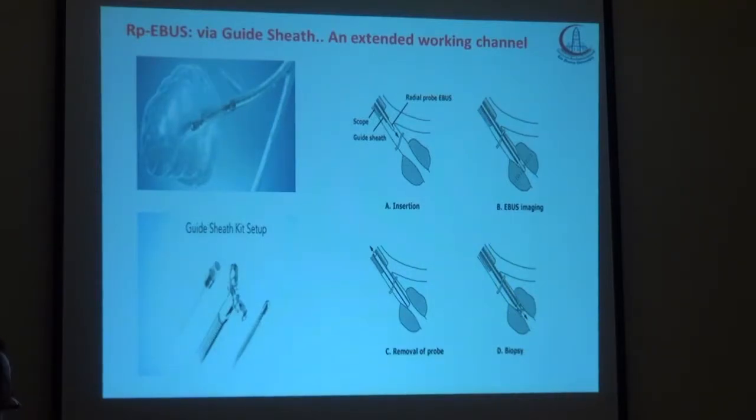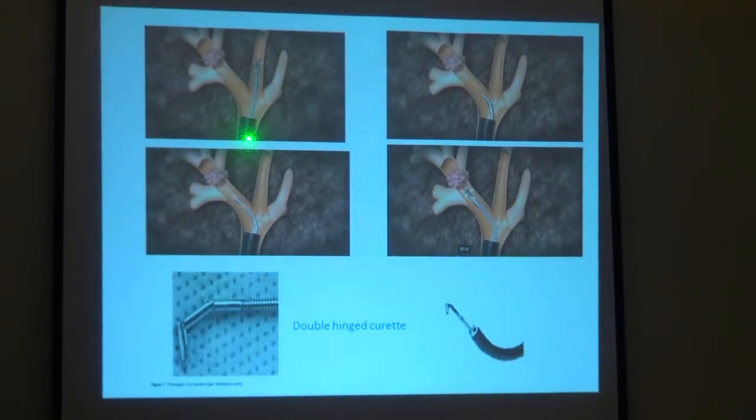أو بالبراش. طب في مشكله ساعات ان انت تخش بالمنظار وتيجي تدخل الفورسبس أو البروب ما بتعرفش تخش، وكل ما تدخله في الحته دي مش هتقدر تلف المنظار. ففي حاجه اسمها الكيورات، دبل هنج كيورات، دي عباره عن حاجه ليها تو انجلز تقدر تساعدك في الحته دي. فانت بتدخل الكيورات الاول قبل ما تدخل البروب، بتخش على جنب كده عشان تقدر تعمل لها ليدنج، مره تدخلها كده وممكن تدخلها بالعكس لو عاوز تخش في حته ثانيه، وبعد ما تدخل الكيورات تدخل عليها الجايد تشيز اللي احنا شفناه، وبعد كده تطلع الكيورات، وتدخل السونار، وبعد كده الفورسبس. الهنج كيورات دي برضه هتبقى ظريفه ان انت في السايد ويز تقدر تعمل القصه دي.